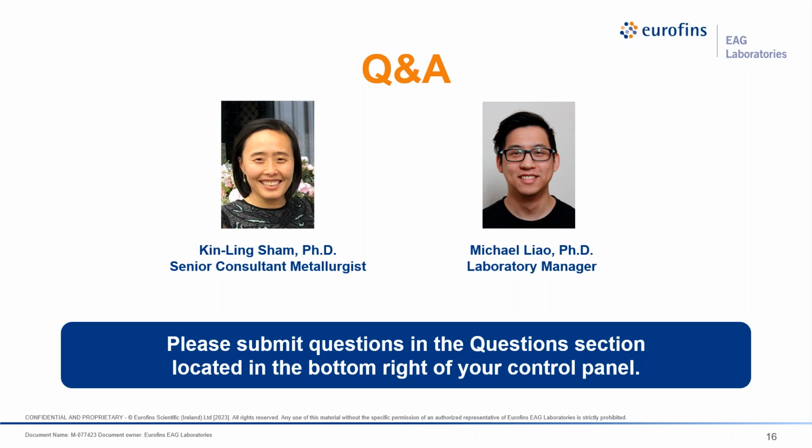In the ISO 10555 test, what is the purpose of immersion in boiling water? Is it to induce thermal expansion of the sample, or to initiate and propagate any pitting that may have occurred during the saline soak? I believe it is to exacerbate any pitting that has occurred in the saline soak.